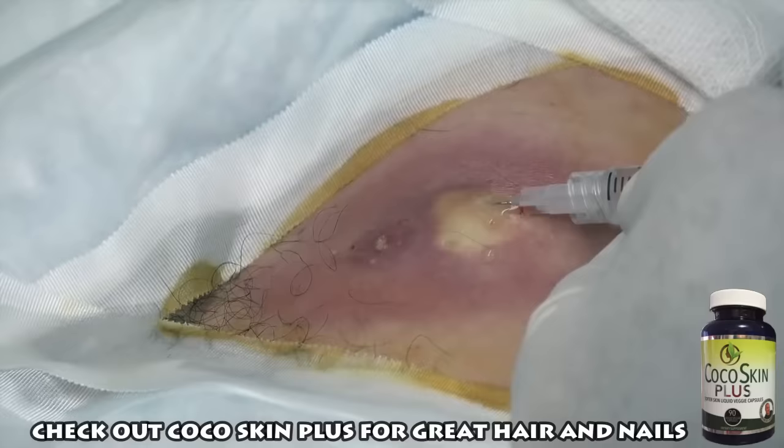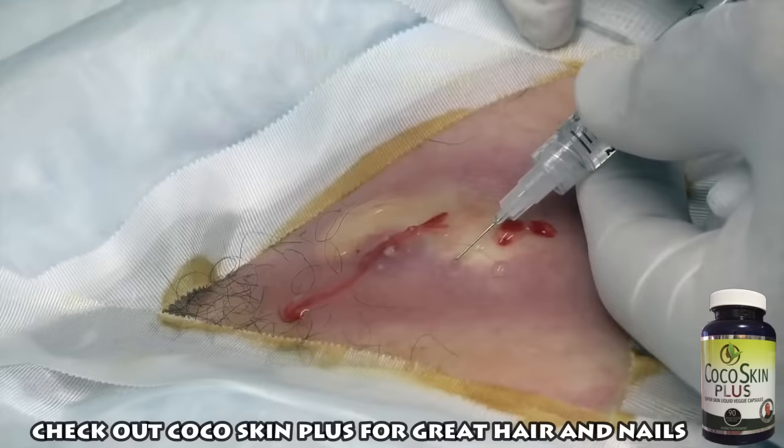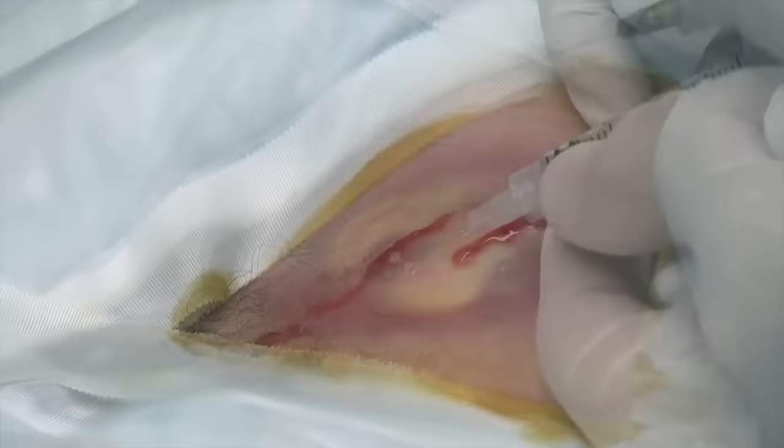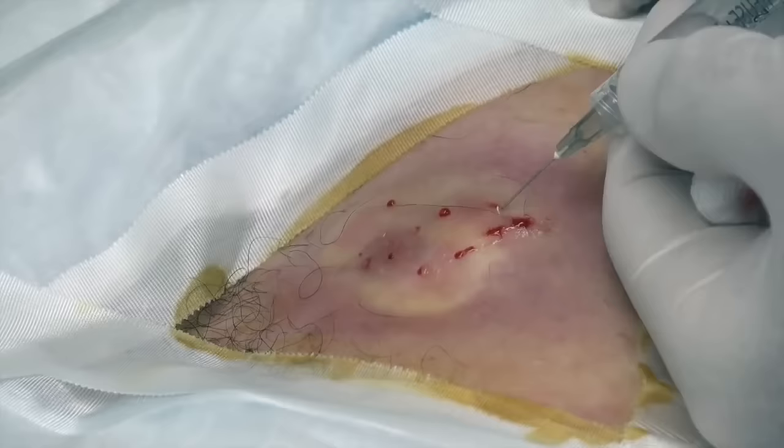Stick, sting, and a burn. Big K, did that hurt much? No — a little sting. So we're just going superficial. Because we're doing the superficial injection, then we're going to come back with a little bit deeper injection here in just a moment. That's going to be a deeper stick, sting, and a burn. We're going to try to get underneath it with this one.